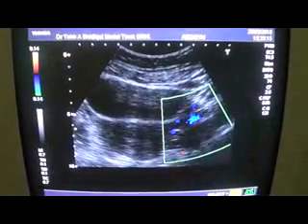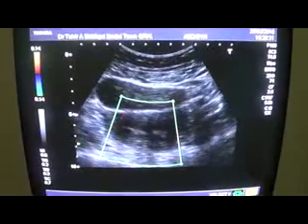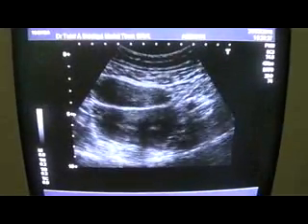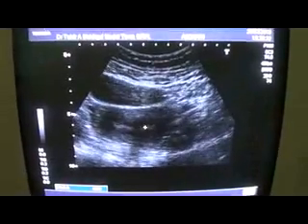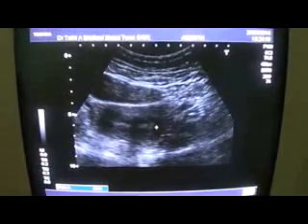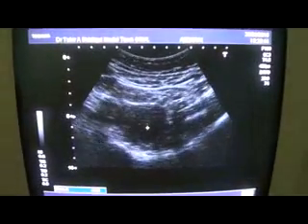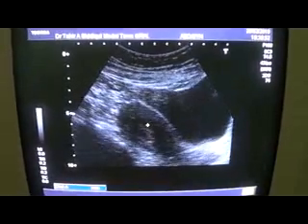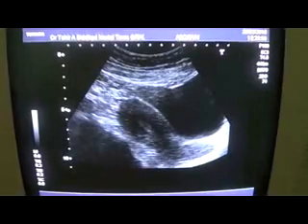That relates to the two endometrial canals, normal echogenicity. Now what I am going to do is take this cavity in view and then make it longitudinal. This is the transverse section of the uterus. I am going to use this endometrial canal, and give it a 90 degree sweep, keeping the canal in the center, and here we see a full longitudinal view of the uterus.